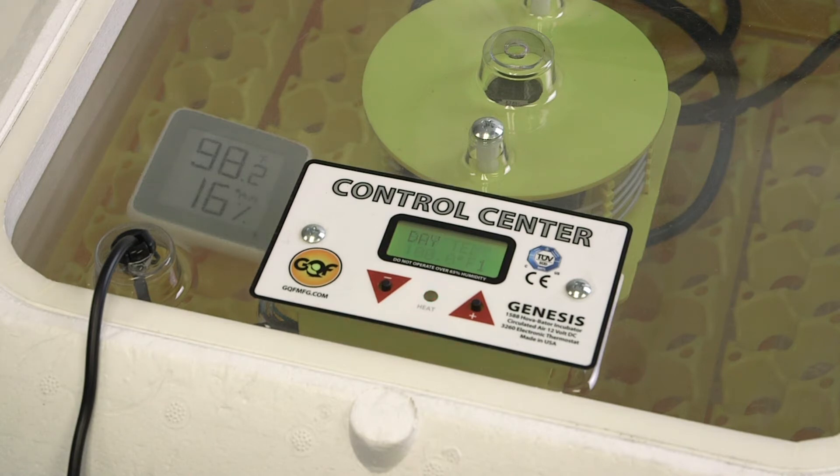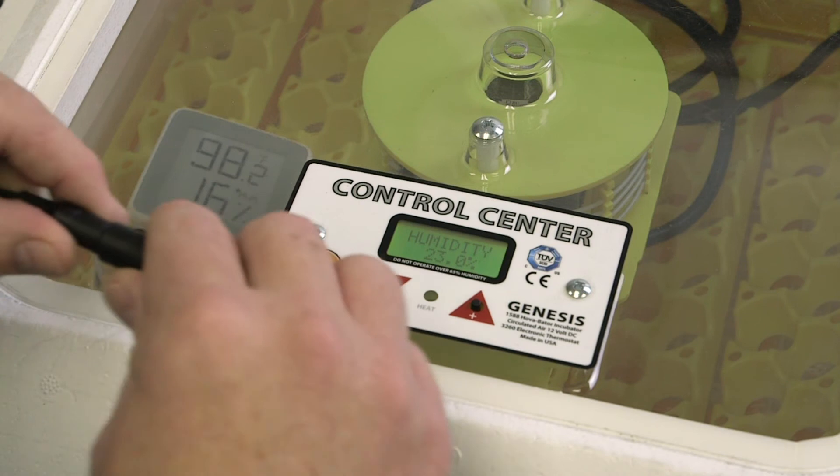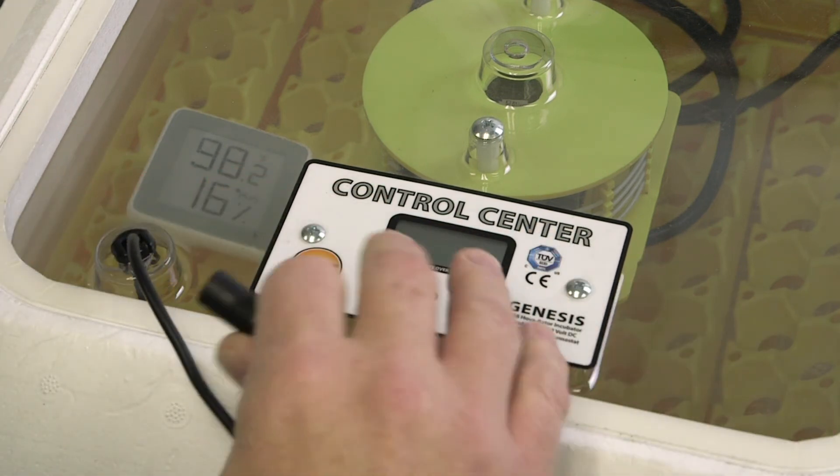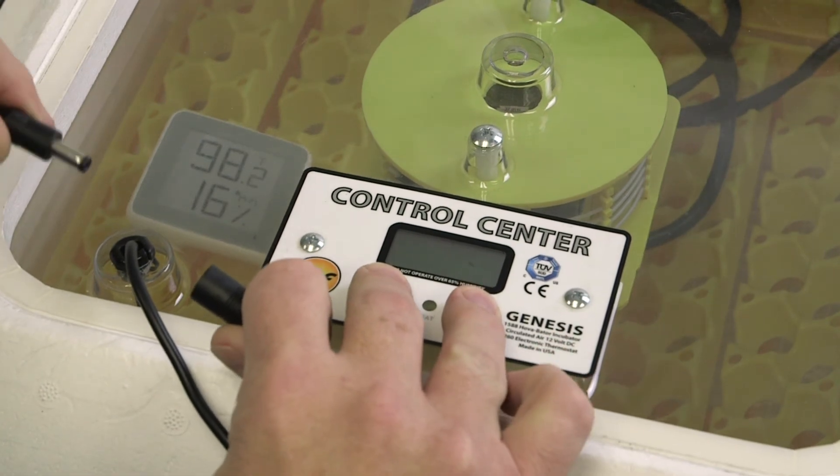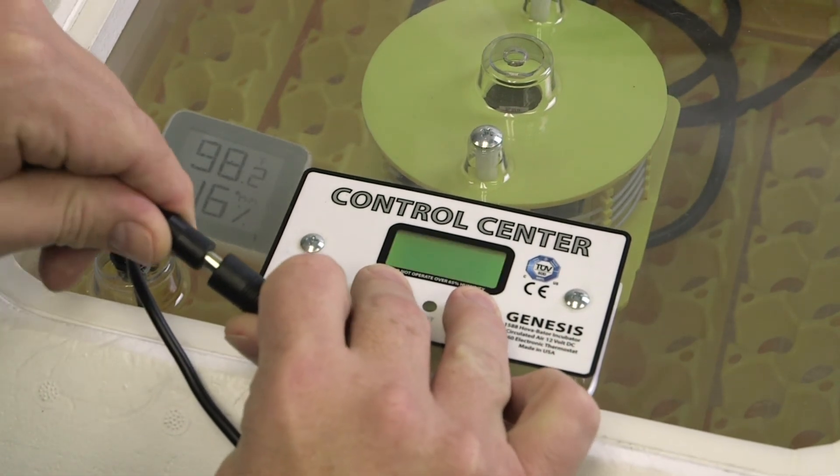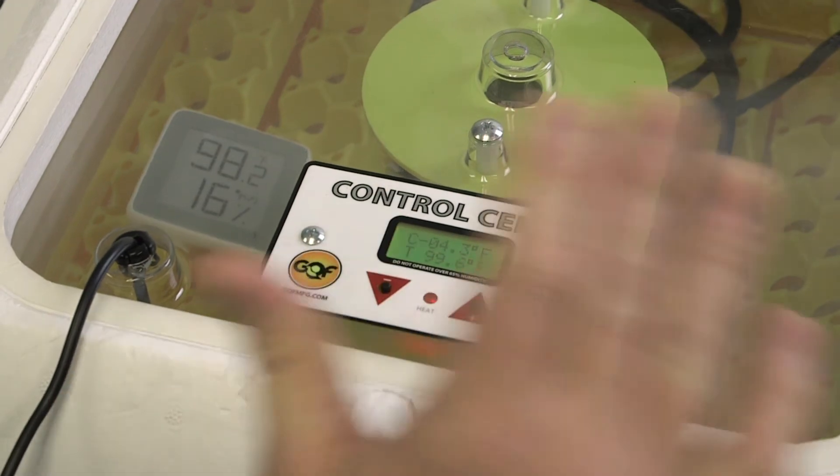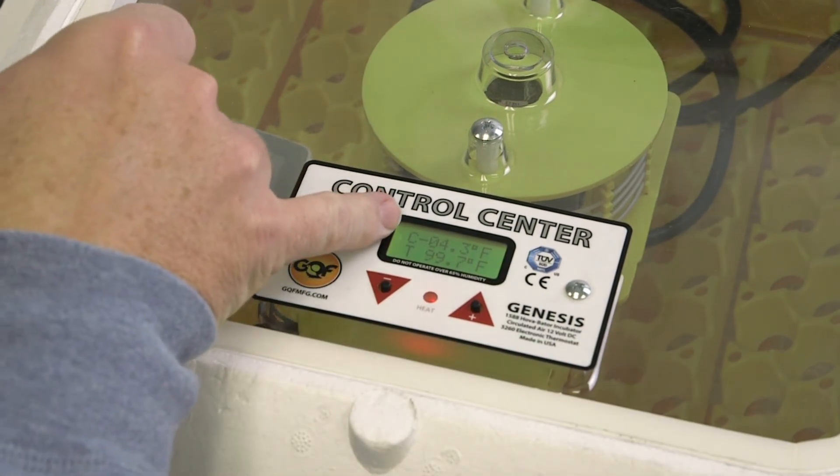You're going to unplug the unit, press and hold both buttons simultaneously while you plug the unit back in. You want to hold these buttons for about four or five seconds, and you'll notice there's a C, that means calibration.